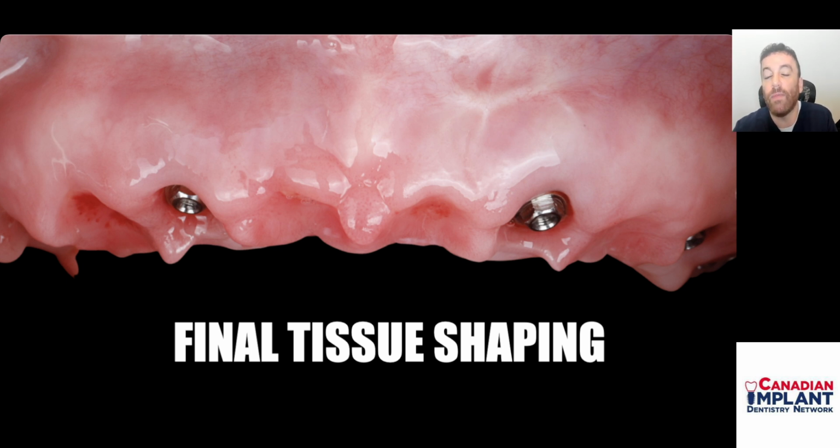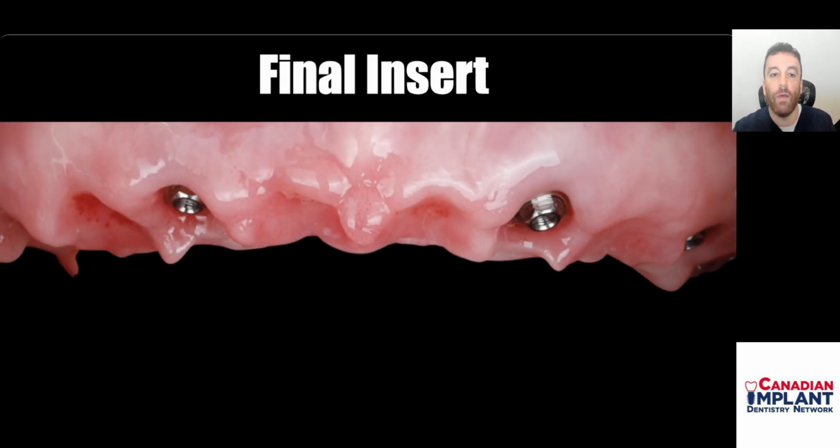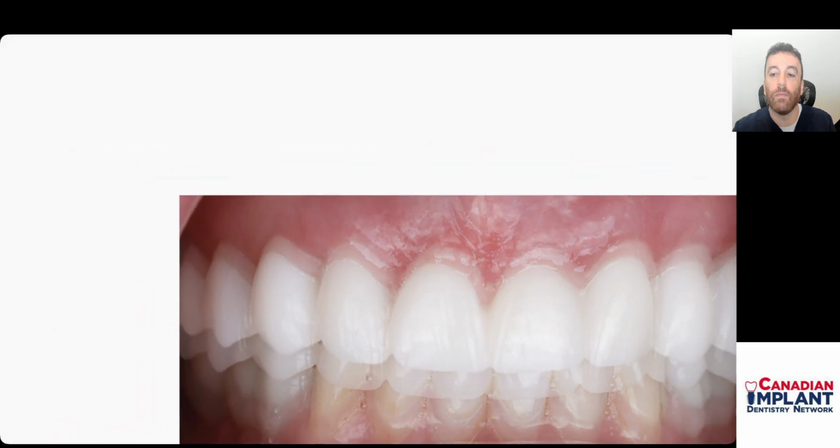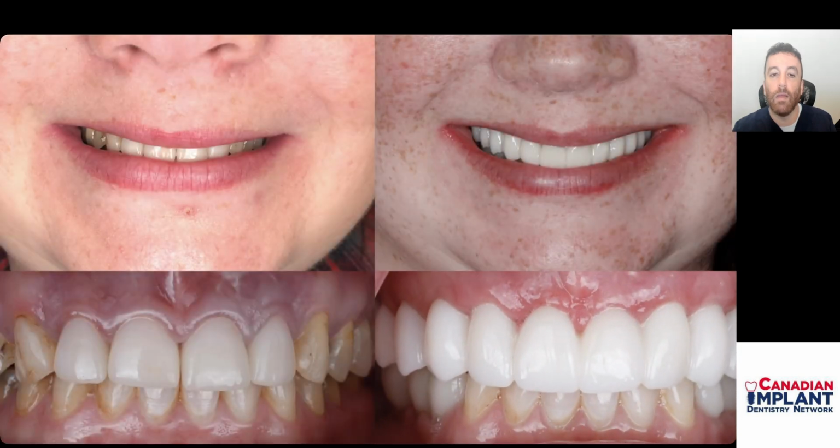We're able to develop that tissue to create something that is very aesthetic without loss and collapse of tissue, and not having to resort to bone from a bottle, tissue grafting, or synthetic products. You are just using what the patient has come in with. Final insert of the case for the patient. And the patient here was thrilled with the result.